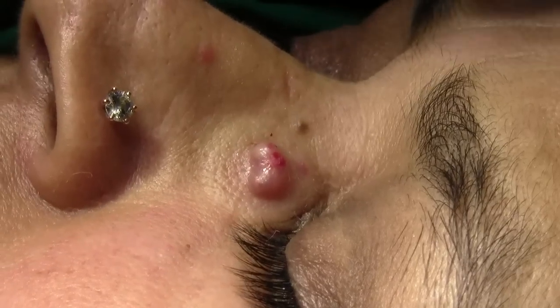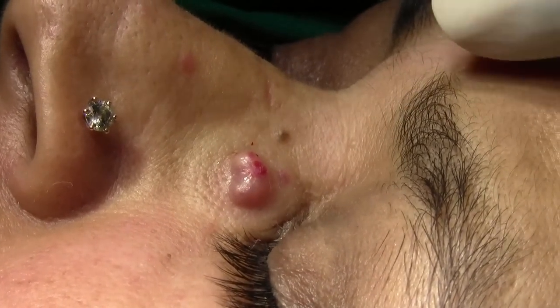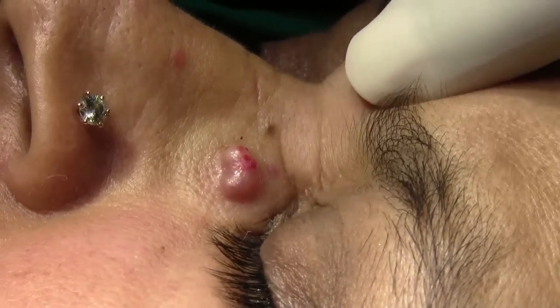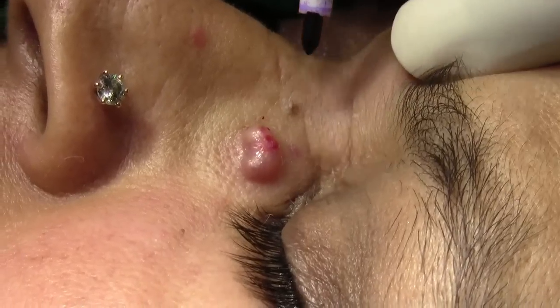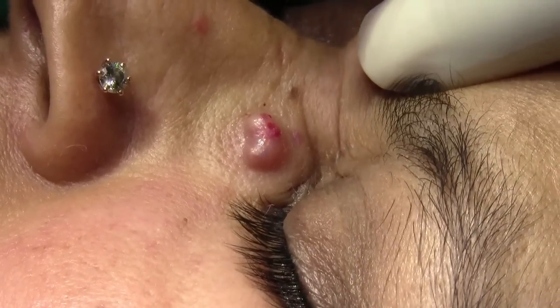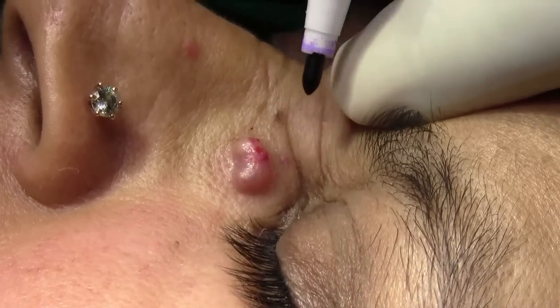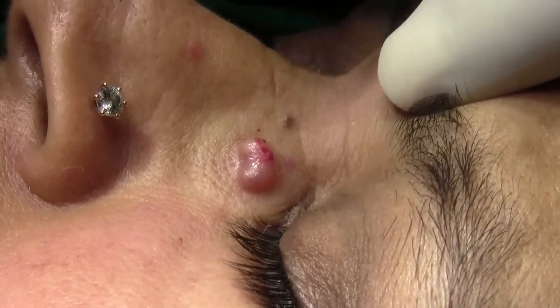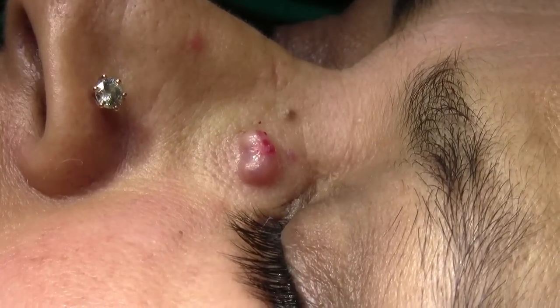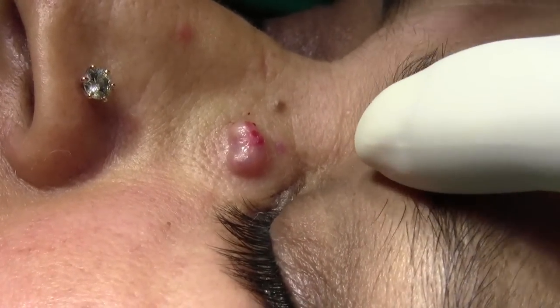Since the direction of incision in this area is along the relaxed skin tension line, it means the direction should be like this. But the axis of this retention cyst is against the skin tension line, so that is why I am going slightly against the RSTL.